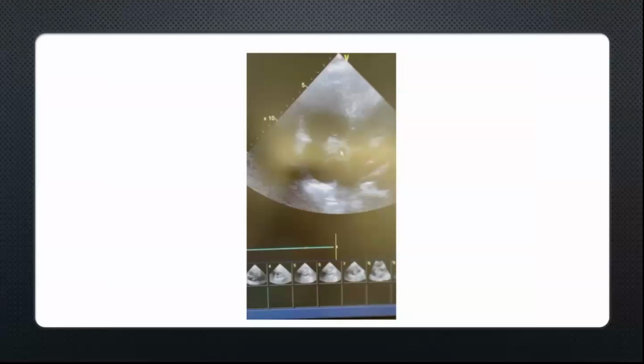This is actually a very cool case that I saw when I was an R2 here doing ICU. So this is a lady, it was taken on my phone actually on bedside ultrasound. She was 30-something, unfortunately broke her ankle and was sent home to wait for surgery. She was obviously immobile during the time. They took her to the OR. And when I was on ICU, we got called emergently because this is what they saw on bedside echo.